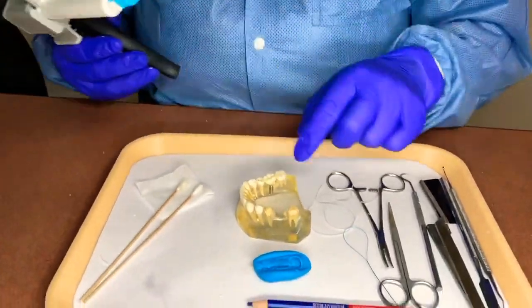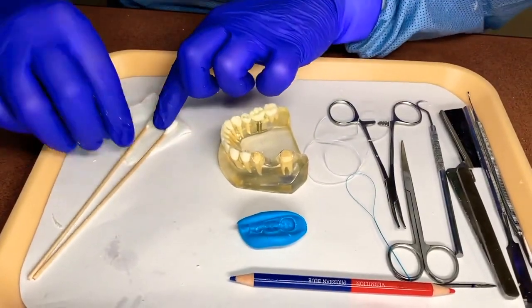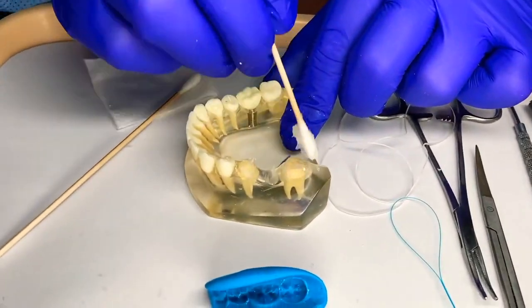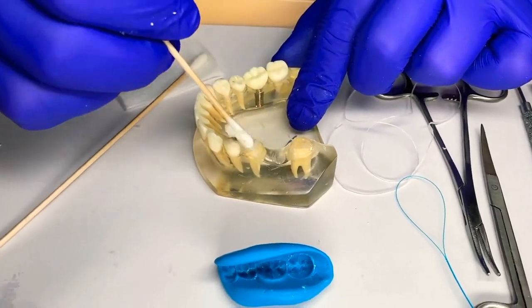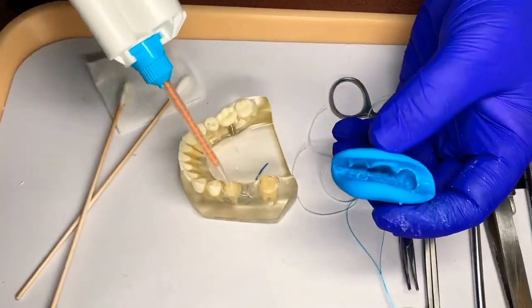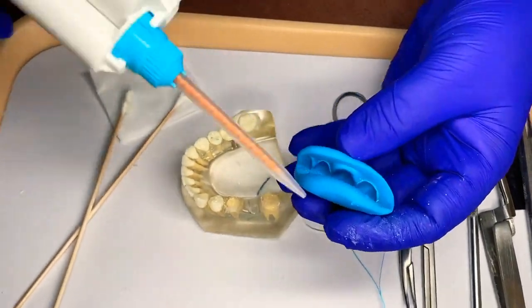I'm going to put just a little bit of Vaseline around because this is a plastic model — in a patient's mouth you wouldn't have to. This is a demonstration. We make sure we have our 18, 19, and 20.